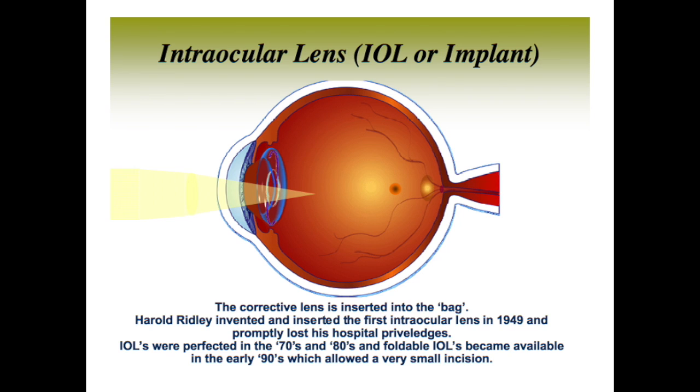And what he noticed was that this plastic that was lodged in the eye sometimes for weeks, unlike other foreign bodies inside the eye, there was no inflammatory response. It just lied there. And he said, "Wow, that's interesting. Maybe I could use this type of plastic and use it as an intraocular lens for cataract surgery."